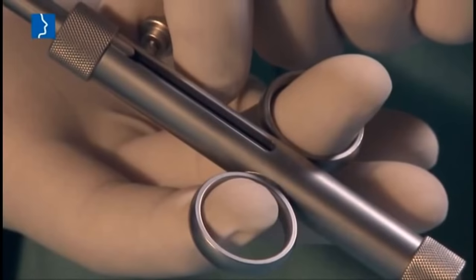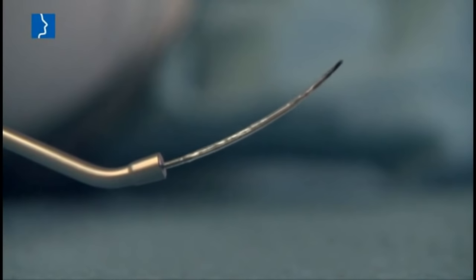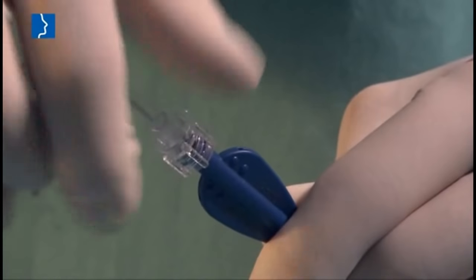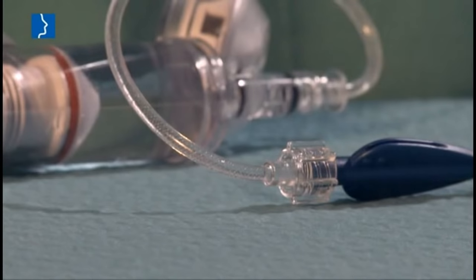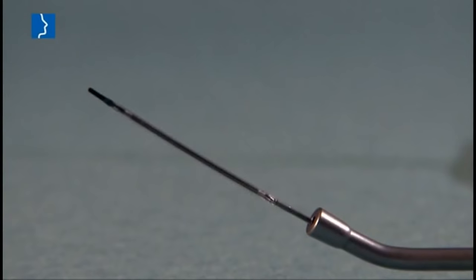During the operation, the balloon catheter is pushed forward within the insertion instrument. Connect the inflation pump with the catheter either prior to or during the operation. For actual dilatation, put a pressure of 10 bar on the balloon catheter.